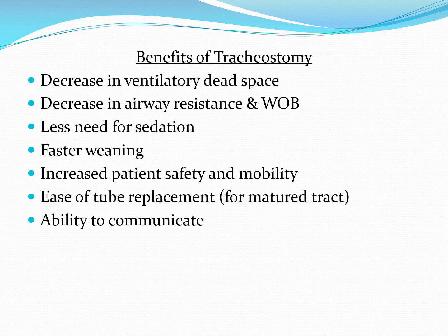Increase patient safety and mobility. Even though patients can accidentally get decannulated, the likelihood that they get decannulated in an unplanned fashion is much lower than the risk of a patient who has an endotracheal tube having an unplanned extubation. So they tend to be much better tolerated, but also they're much more stable in terms of remaining intact and not subject to accidental removal.